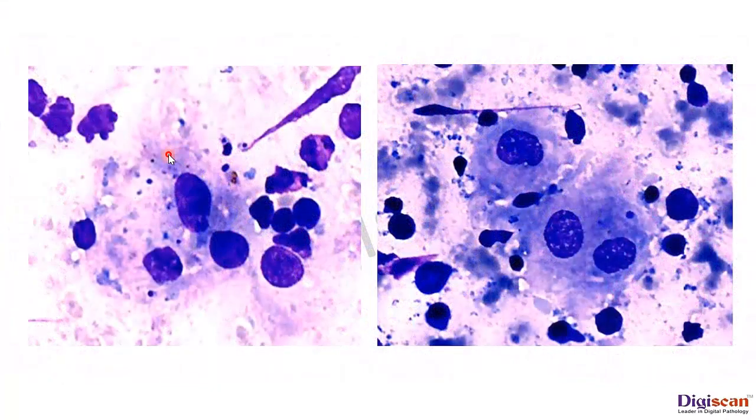On higher power, we can appreciate that within the cytoplasm of the macrophages, there are numerous organisms. Here is one, and here is another. So these organisms have a nucleus, and then you can appreciate that there is a sort of a flare of cytoplasm. In this one, you can also see that there is a kinetoplast. Here again, we can appreciate another organism within the cytoplasm of the macrophage. Again, you see numerous organisms within the cytoplasm.